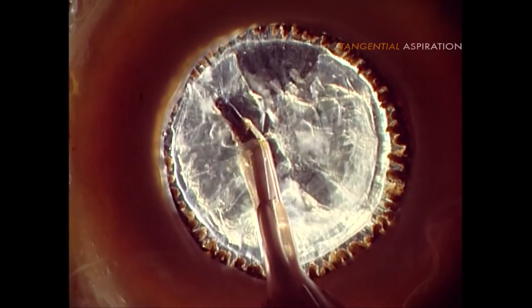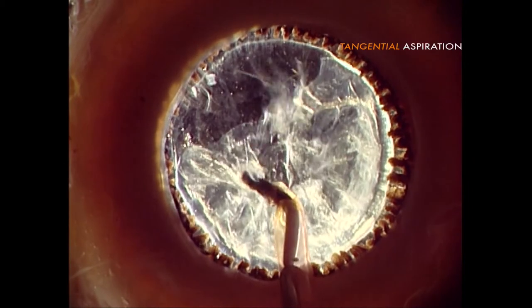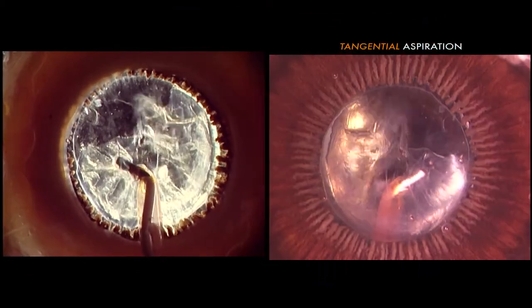These last videos show the continual circular one-step cortical aspiration, frontal view and back view.